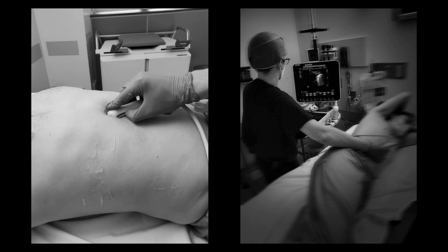The next thing to talk about briefly before we get to the different windows is our patient positioning. This becomes really important because we can optimize and enhance our windows based on how we position our patient. Most of the patients that we see are going to be either in the supine position or the semi-recumbent, semi-sitting up position, and that can be helpful. It's convenient, but unfortunately we have a very small space that we need to identify to look at the heart. If you remember your anatomy, the heart is buried in the mediastinum, and flanking it on either side you have two big lungs.